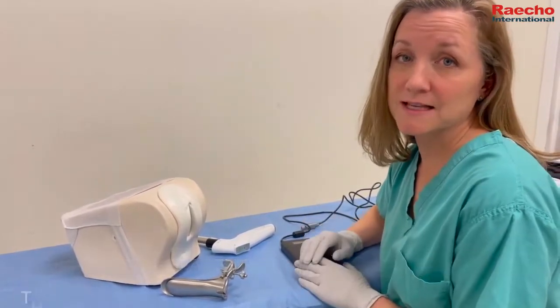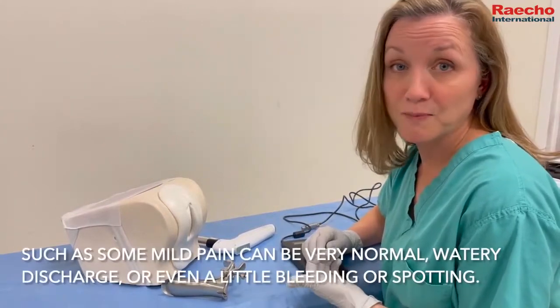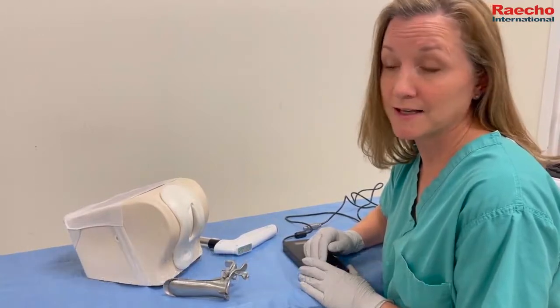Let the patient know that there are some side effects they may experience after the procedure, such as some mild pain, which can be very normal, watery discharge, or even a little bit of bleeding or spotting.